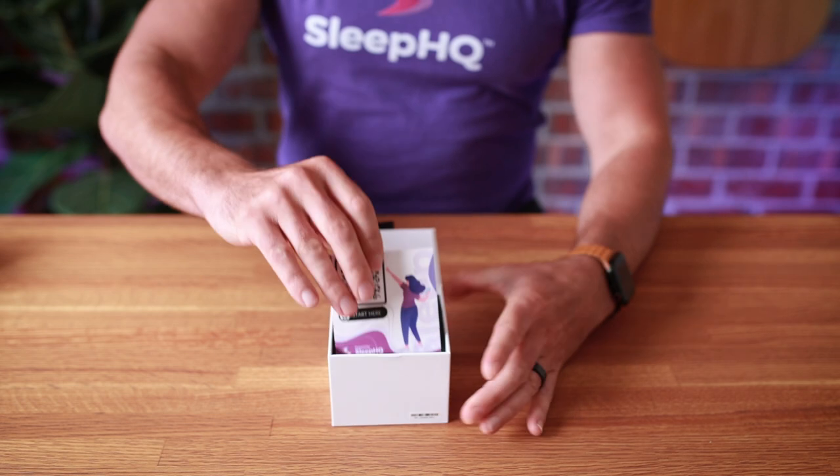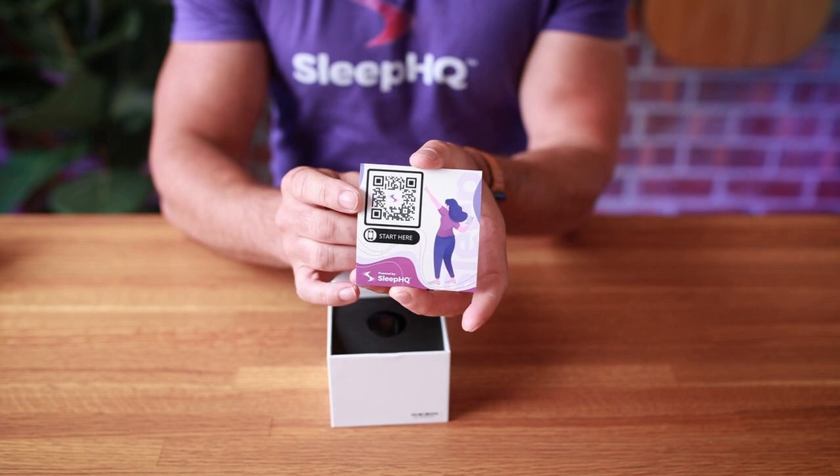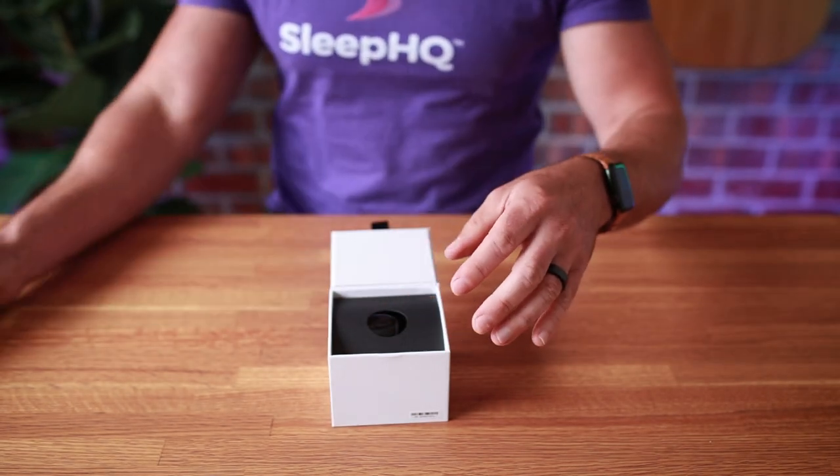Inside the box is a card with a QR code. Just scan that QR code and it will take you to a page with all the instructions and all the app links, saving you from having to look around for them.